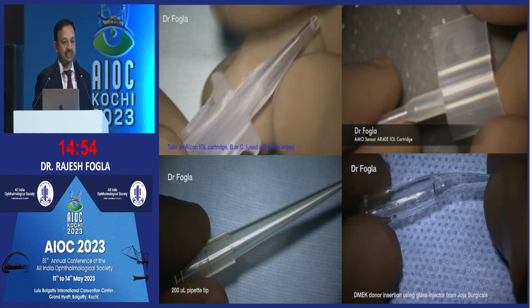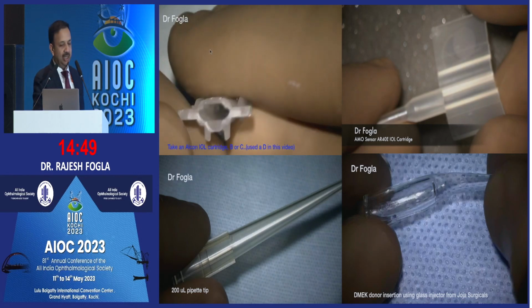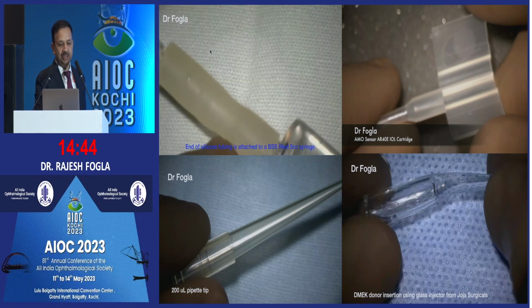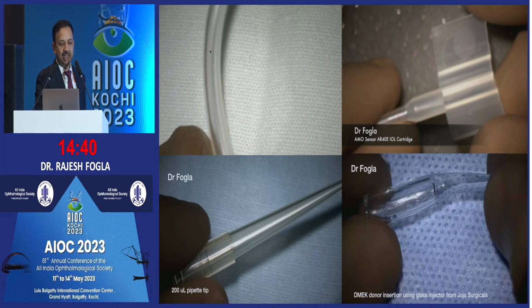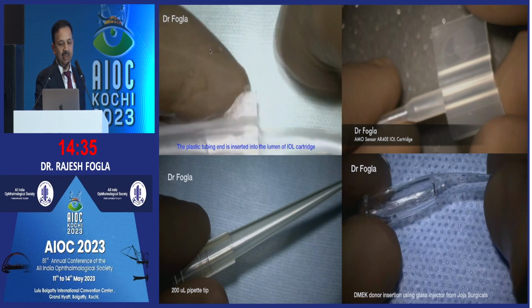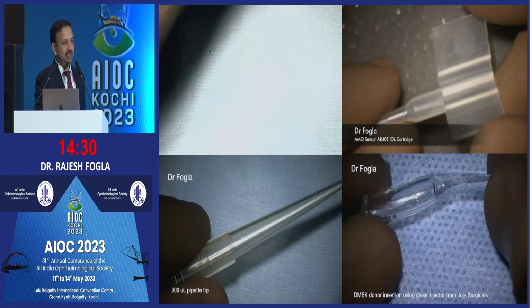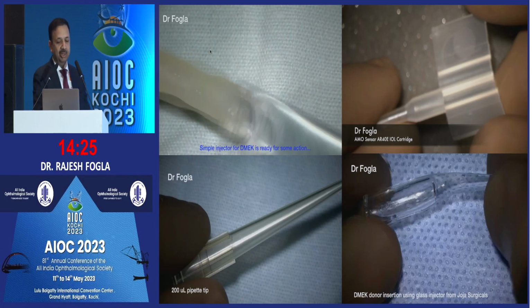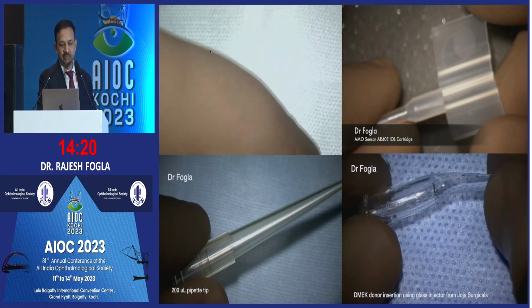Now, looking at some of these injectors, this is from your Alcon cartridge. You can take either the B or the C cartridge. You can take a syringe, put a silicone tubing in the front or your IV tubing set, and the other end of the tube will go inside the Alcon cartridge. So that becomes your DMEK injector. Just make sure that the connection is tight and it is watertight. This was described in a paper published in Cornea back in 2014. We did try using it and it works pretty well.